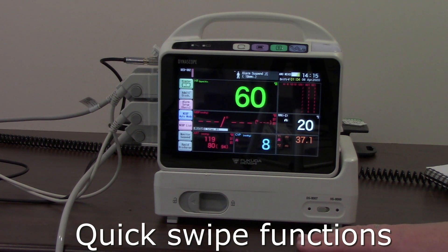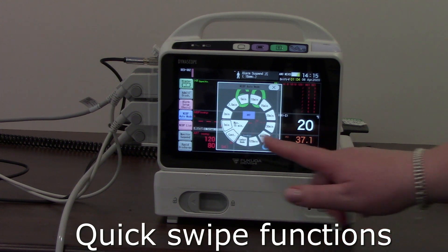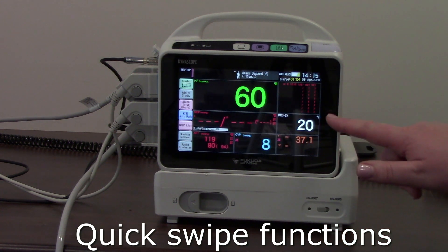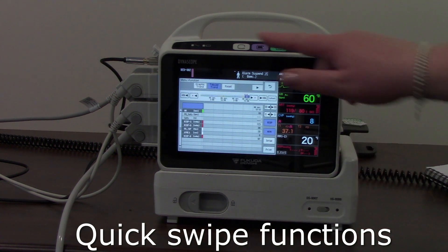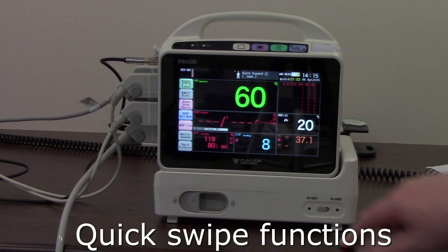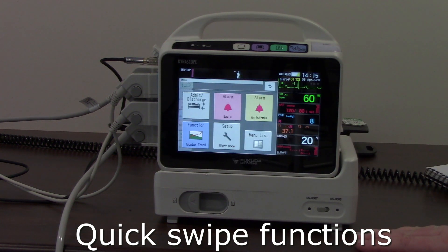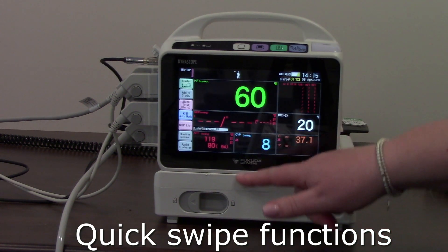There are also some quick swipe keys. If I drag from the top to the bottom it brings up my NIBP auto. If I go from the right it brings up my trends. Using the home key, if I go from the left into the centre it brings up my menu. There isn't a swipe gesture from the bottom upwards.